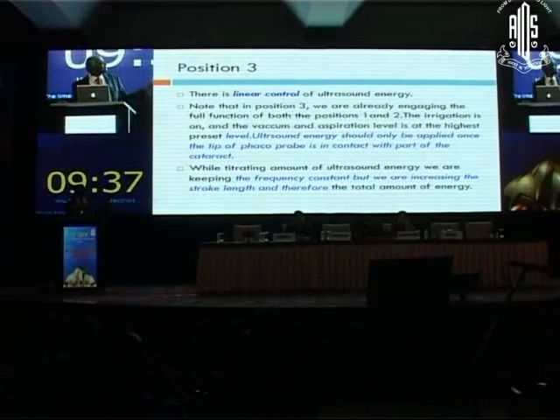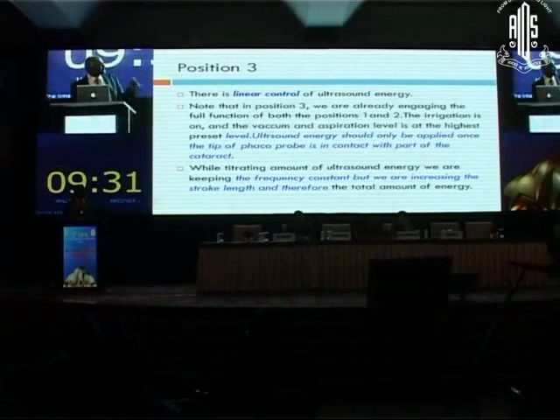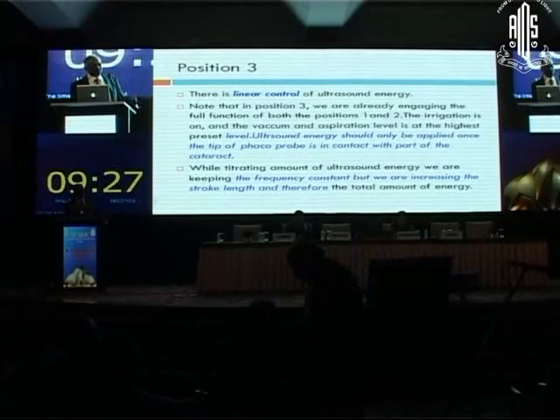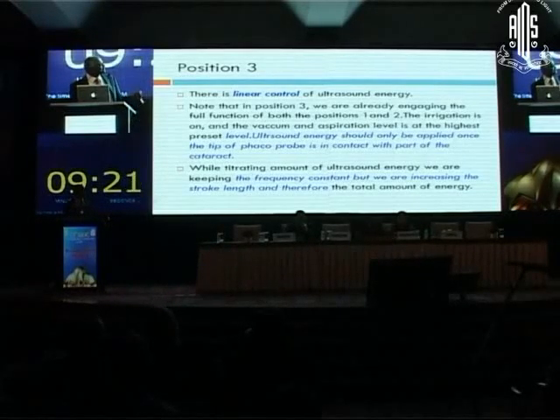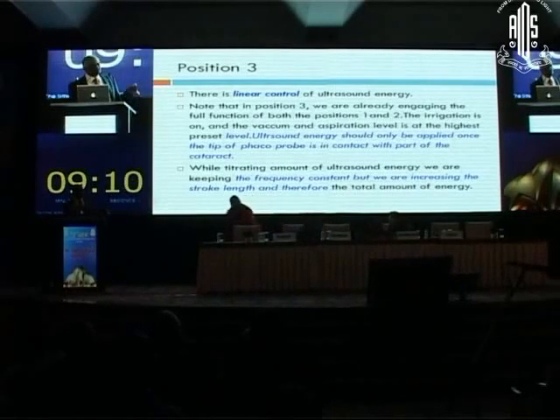Now there is a linear control of the ultrasound energy also. Note that in position 3, we are already engaging the full function of both position 1 and position 2. The irrigation is on, and the vacuum and the aspiration level are at the highest preset level. Ultrasound energy should only be applied once the tip of the phaco probe is in contact with the part of the cataract.